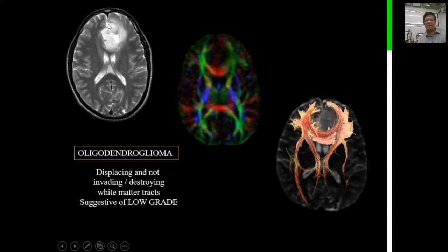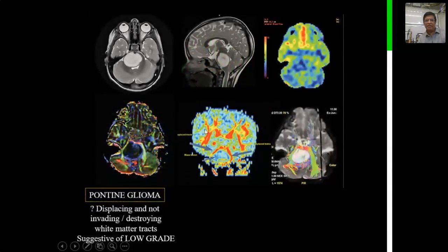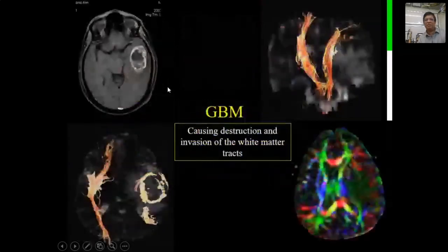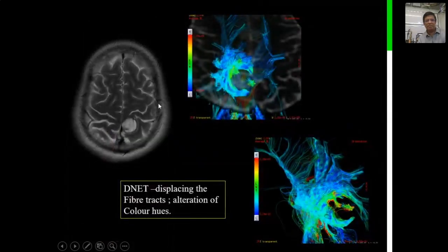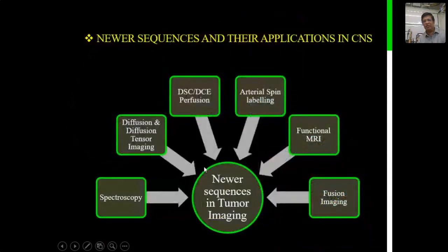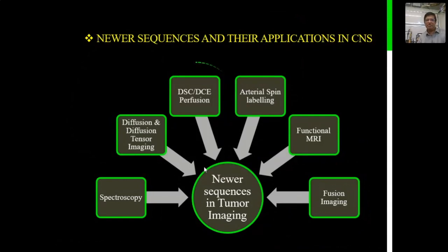Here are actual examples. In a left frontal lobe oligodendroglioma, the tracts are displaced but not infiltrated. Comparing with a pontine low-grade glioma, again the tracts are displaced and not invaded. In contrast, in a glioblastoma multiforme in the left temporal lobe, the tracts are completely destroyed. In a DNET in the left posterior frontal cortex, the tracts are displaced with slightly changed color views, but no infiltration. This illustrates the importance of diffusion and diffusion tensor imaging in advanced tumor imaging.